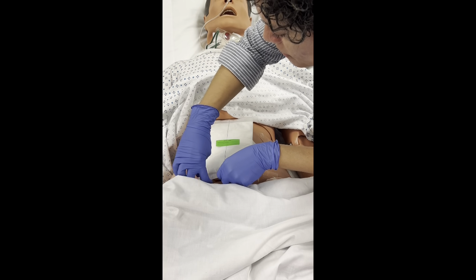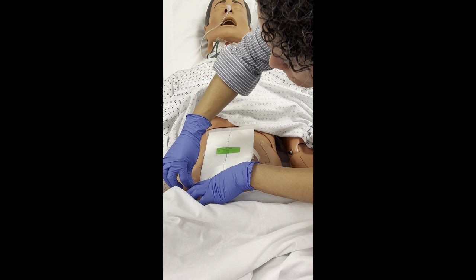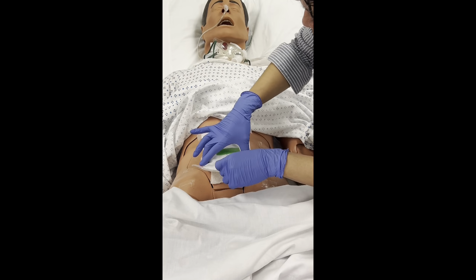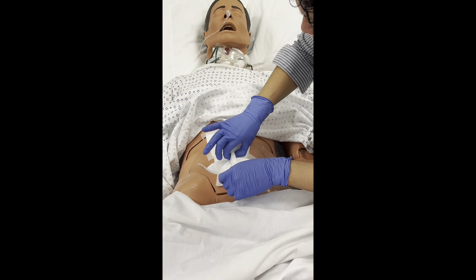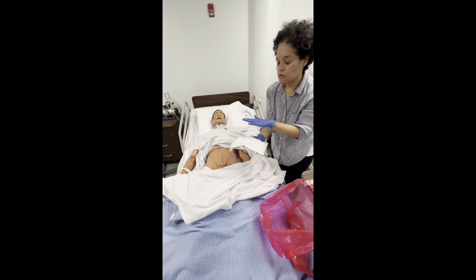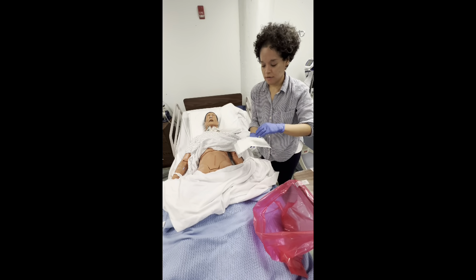Just to loosen the areas. Okay. So as you lift, you have the dressing. You're first assessing the dressing itself.